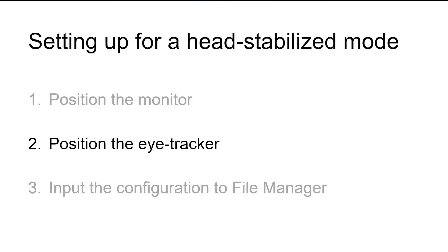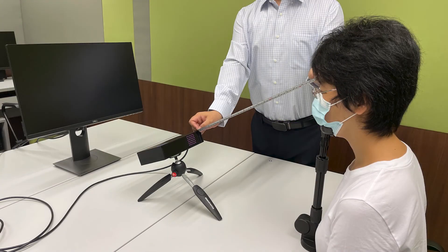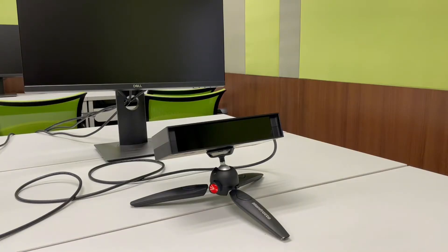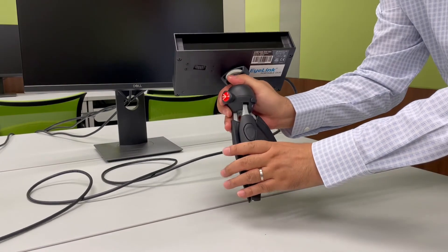Second, position the eye tracker. Put the eye tracker between a participant and the screen. Make sure the camera is around 45 centimeters from the eyes and it does not block the screen. We can use the switch to adjust the height.